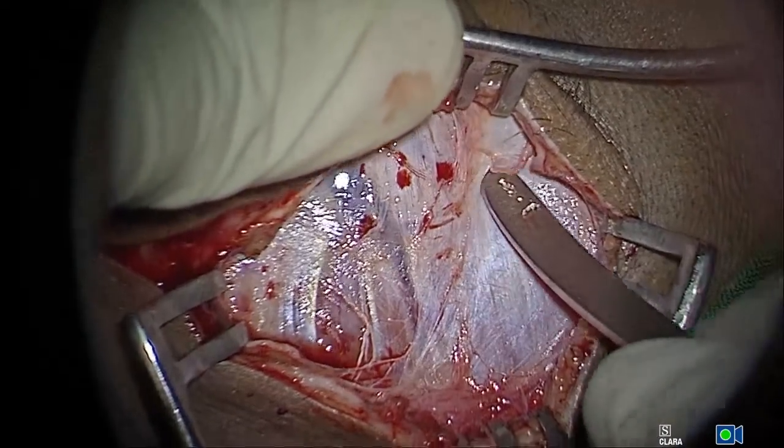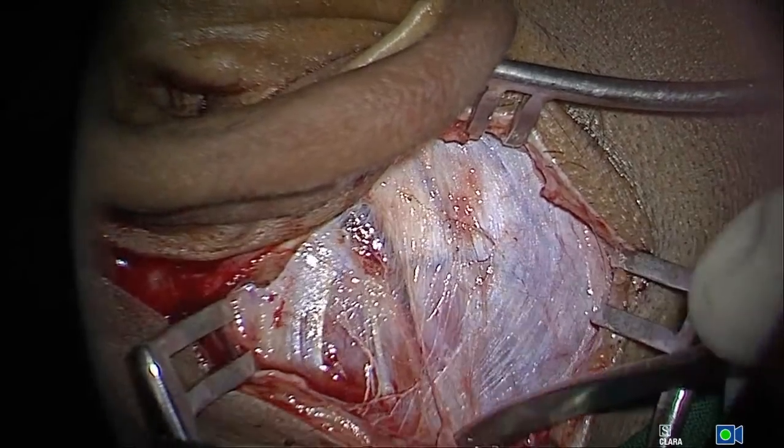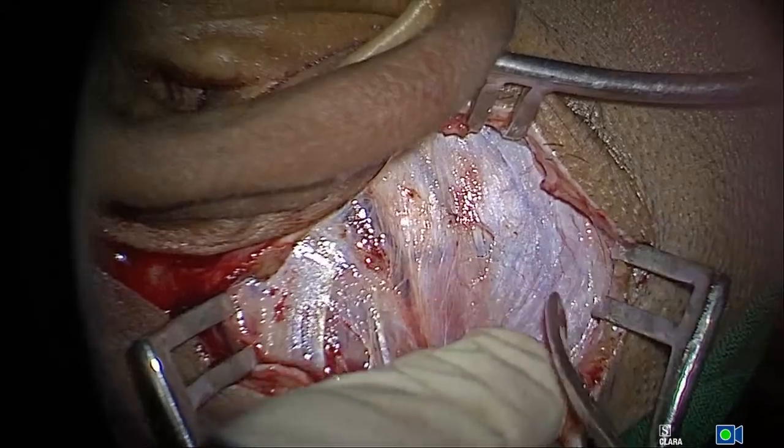These are all the fibers above the fascia. You don't want all these fibers. By just taking off all these fibers above the fascia, make it as thin as possible.